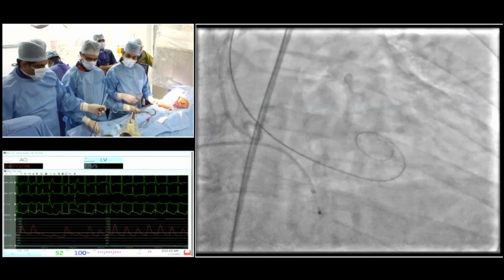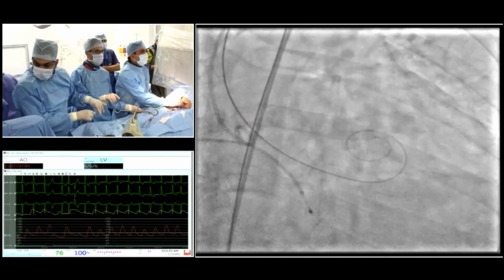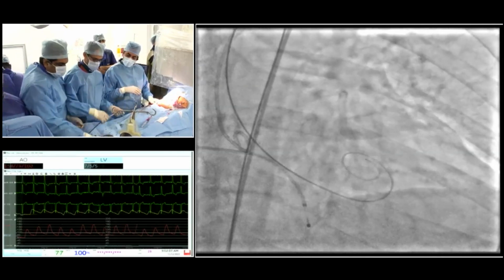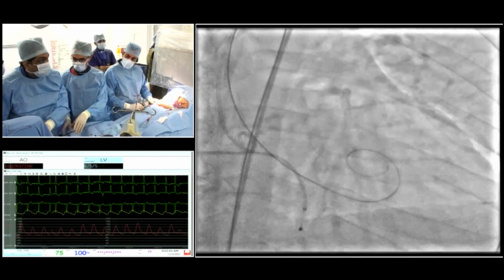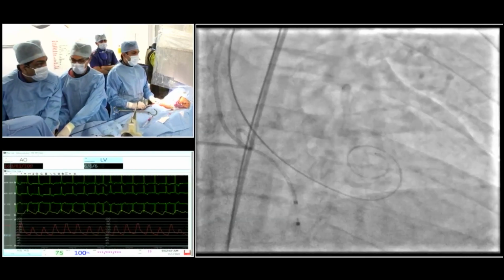I couldn't agree more. So just for the purpose of discussion for the audience, what I was asking about is a technique where you can pace from the stiff wire with unipolar configuration, where you put a clip on the skin and put the second clip, the anode or the cathode, onto the wire, whereby the pacing happens from the wire.